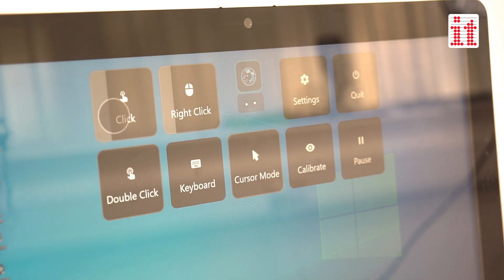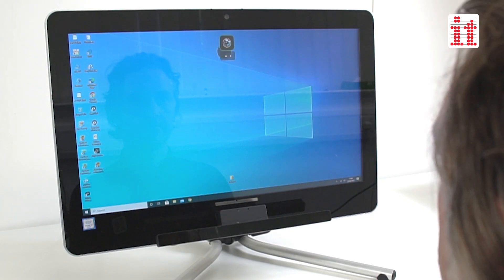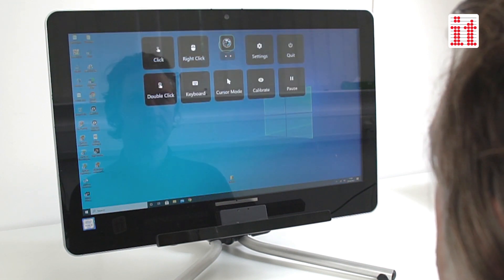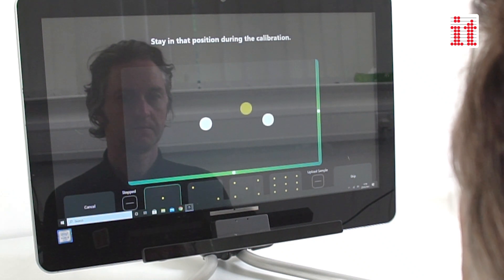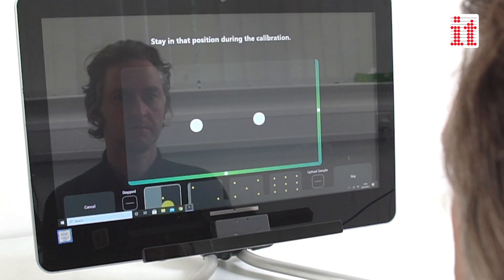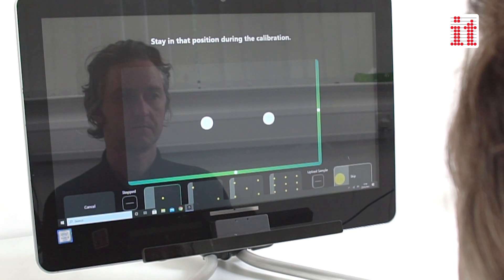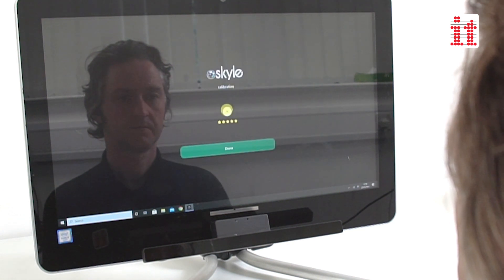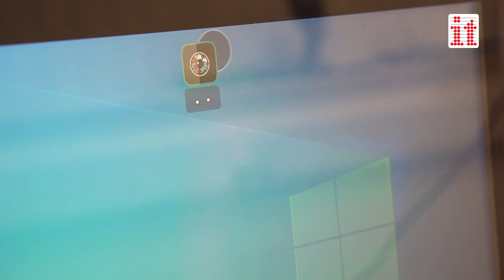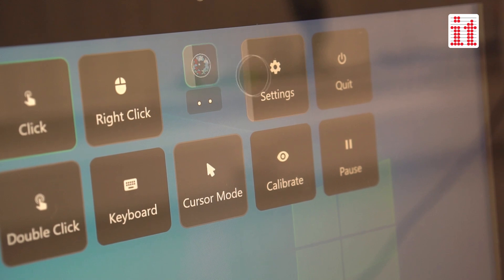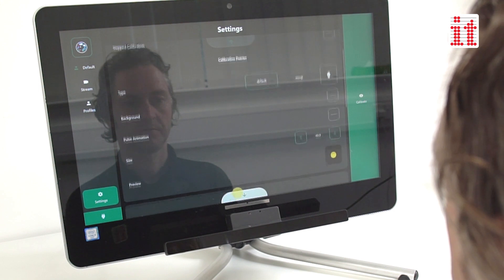Once your device is launched into Windows, Skyl EyeMouse starts automatically, providing instant eye gaze access. An intuitive positioning guide and one-point calibration option offers a quick setup process. Most functions such as left click, right click and double click are easily accessible by clicking the on-screen access button. Further calibration and customization options are available from the settings menu to improve eye tracking accuracy and cater for specific individual needs and requirements.